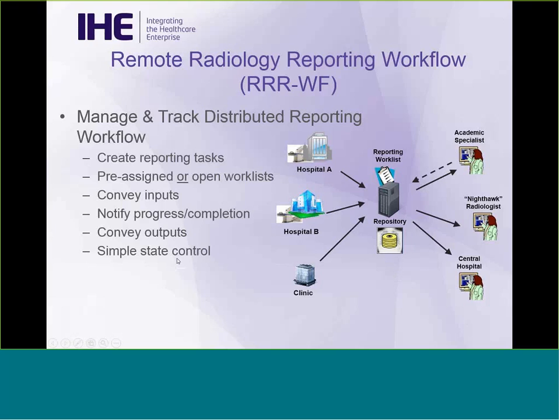And really just a simple form of state control. So you've got these simple work list items. You want to be able to move them through their states from being created to being in progress to being completed, occasionally being canceled depending on some of the exception states.